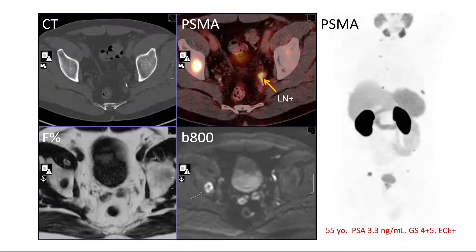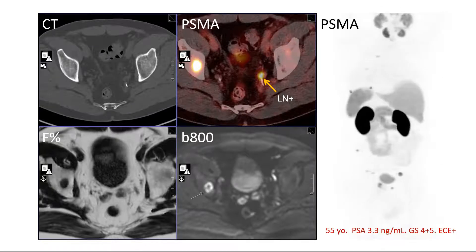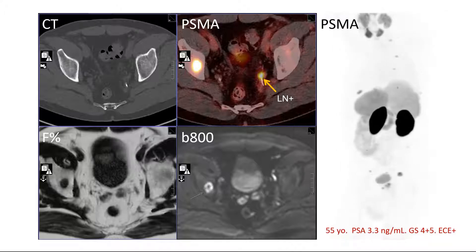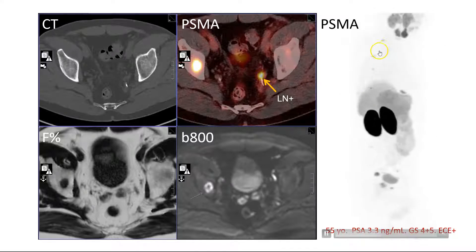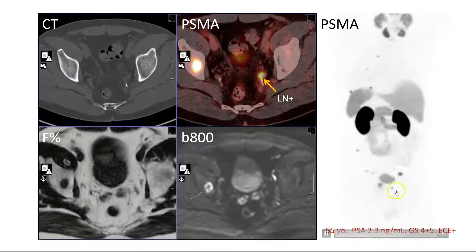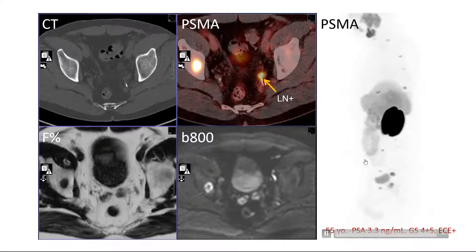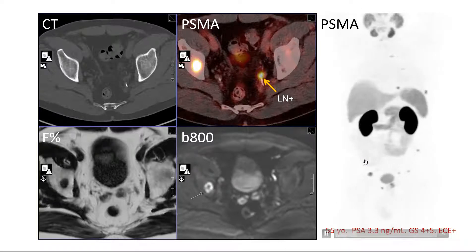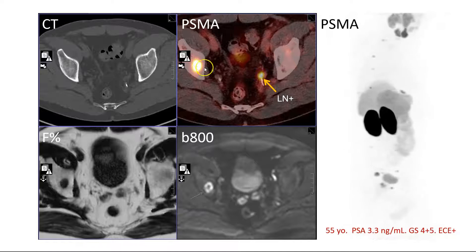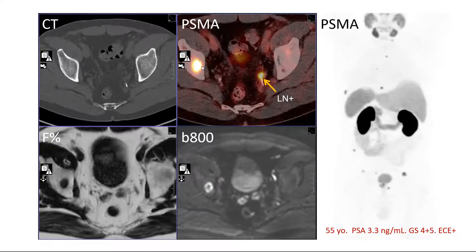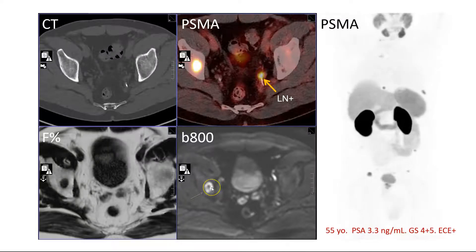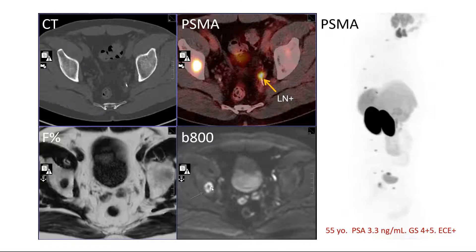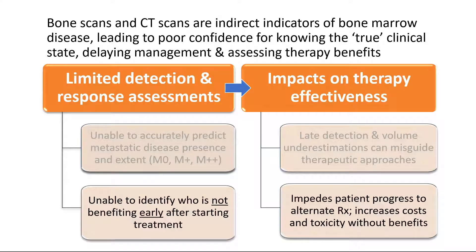When you do a next-generation imaging technology — in this particular case, MRI and a PSMA PET CT scan — what you notice is that he's got polymetastatic disease. On the spinning images, each of these bright spots as the skeleton spins are metastatic deposits, which you cannot identify on the CT scan. Here is the right acetabular roof on the PSMA PET CT and on the whole body MRI, which are very much positive. So this is metastatic disease — that's in the detection setting.